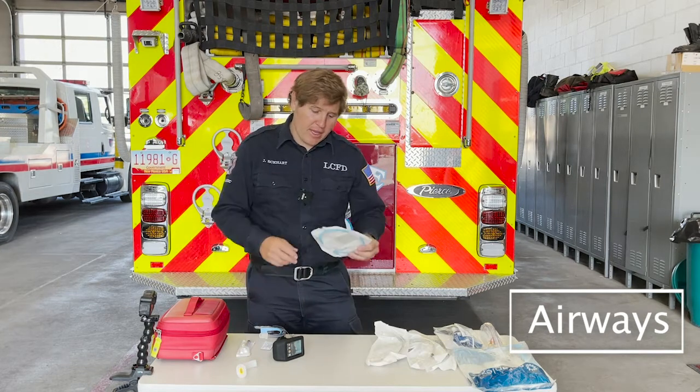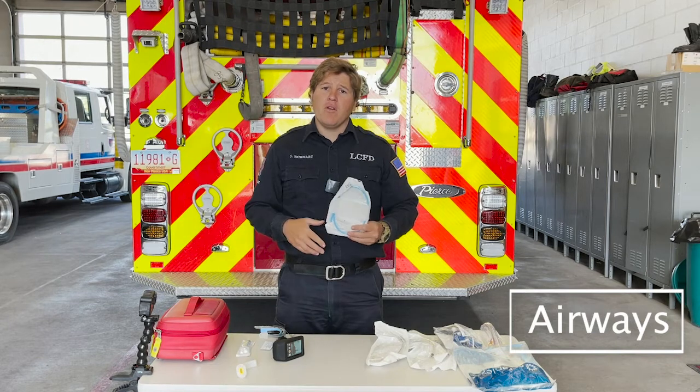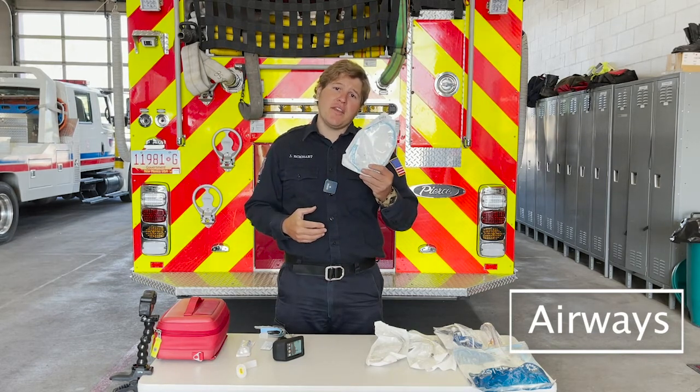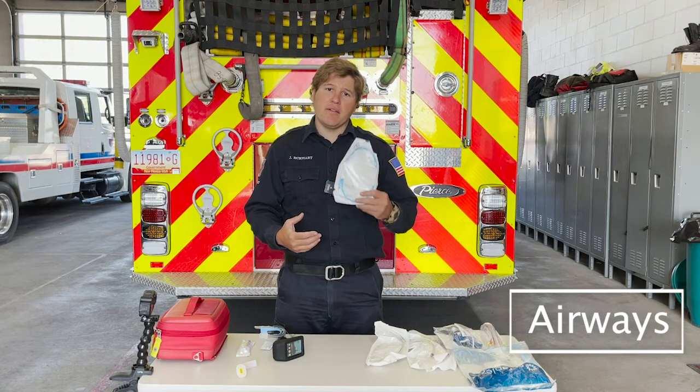Another thing I like to have with me is a bougie, just in case something does happen to that cuff or the tube isn't working right, I can place this into the trachea and switch out a tube. So having this and not having to look for it when I need it will help.